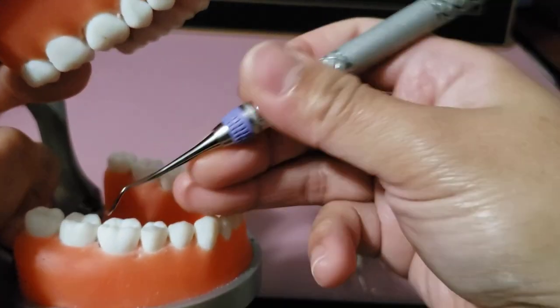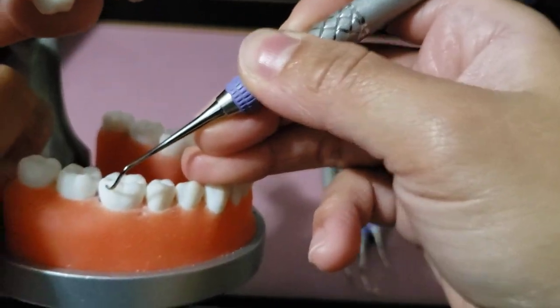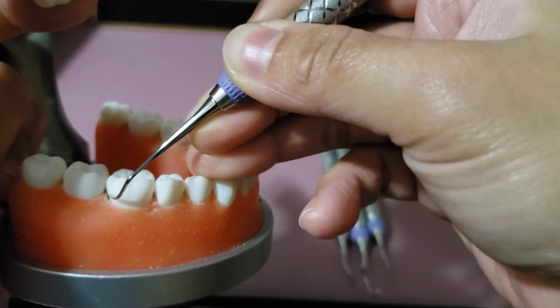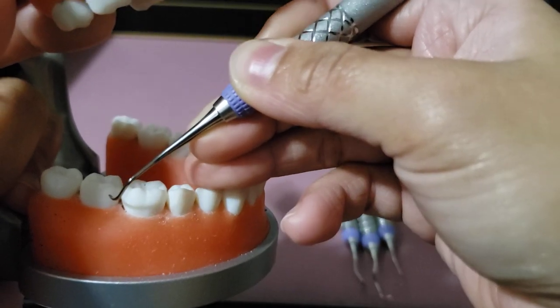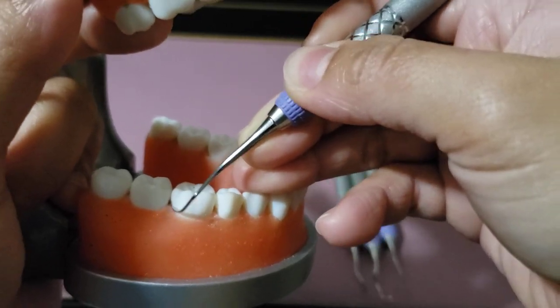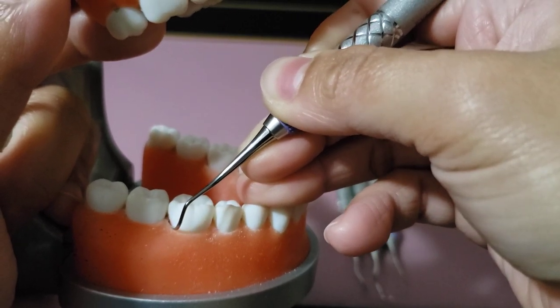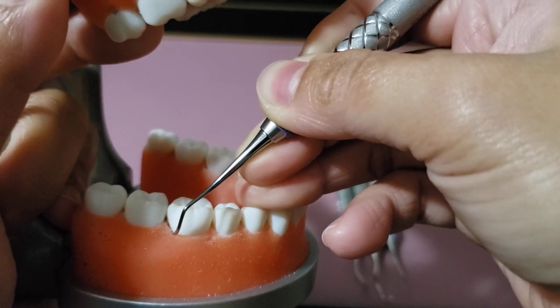Let me demonstrate using a universal curette. First, we close the face of the blade towards the enamel at zero to 40 degrees — to do that I need to relax my fulcrum. Then I close and insert just the tip of the toe-third in the sulcus.